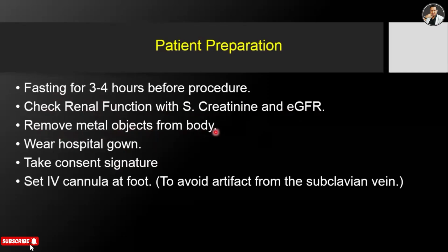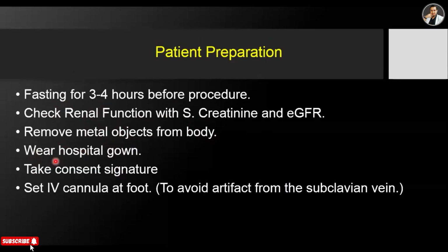The patient needs to be taken to the hospital for a hospital dress, and a consent signature from the patient's guardian. The patient needs to be treated with an IV cannula. This is an important thing.